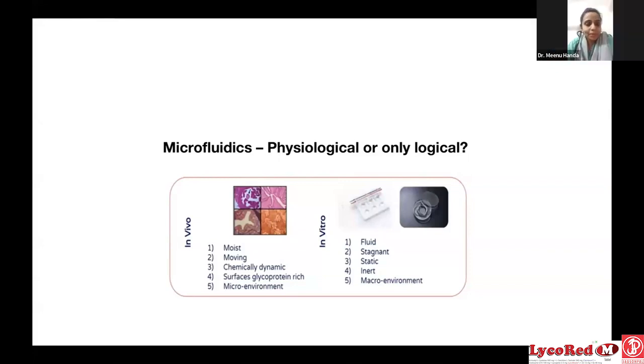Okay. And just to extend what Ved sir has said, you have to look at the technique they're using, because the cutoff values depend on the way you diagnose the DNA fragmentation levels. If you're doing TUNEL, the set of cutoff values is different. If you're using SCD, again that is different. If you're using SCSA, again it will be different. Overall, most labs follow about 25 to 30% as the higher end. If it exceeds that, then the decision is taken to go for microfluidics and MACS, but not for every patient.